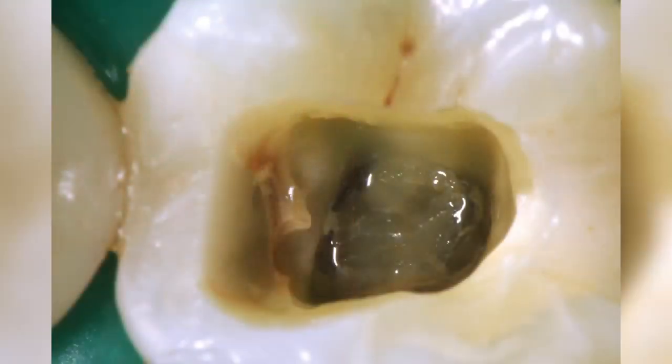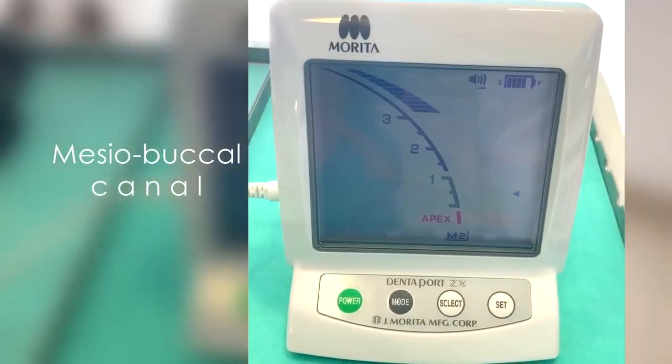After access preparation, the reason for pulp necrosis is evident: carious tissue left under the restorative materials. This is meticulously removed and root canal orifices prepared.